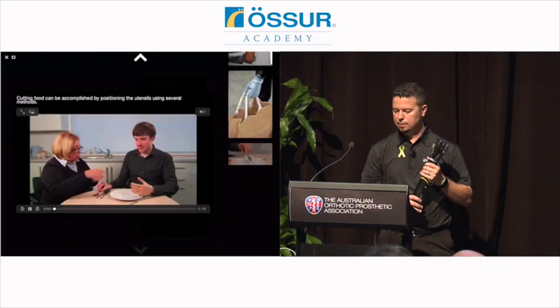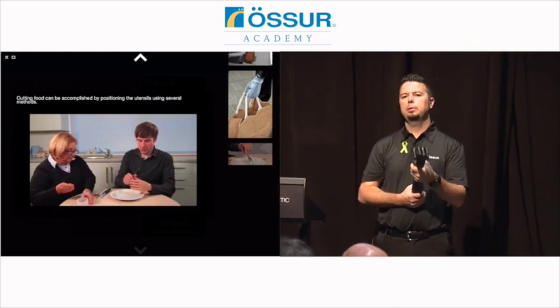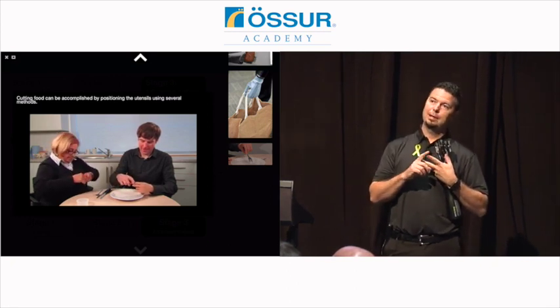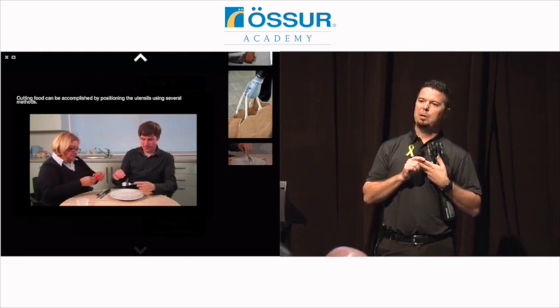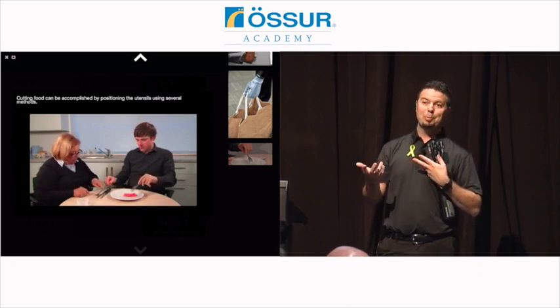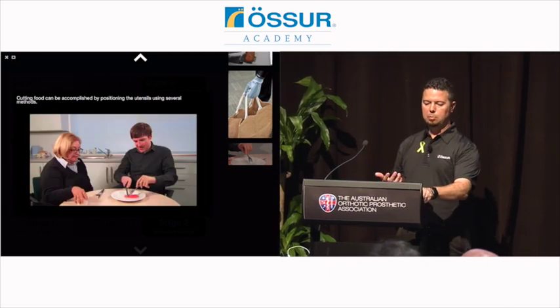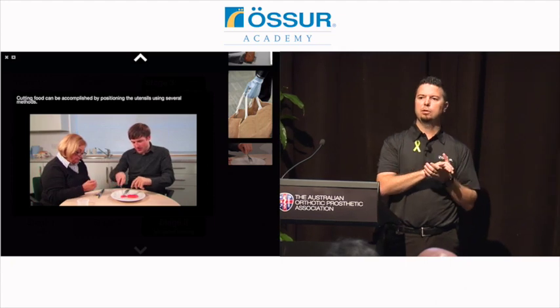And then the last thing is utensils. We did a study with a university in our area. We asked people, since their amputation, what was the most difficult thing for them to do, but most important to them? So it had to be difficult, and they had to care about it. And number 1 on the list was cutting food. And maybe that's just Americans, that we're big carnivores and we like to eat stuff, but most people like to be able to eat and be independent with that. So one of the things that you want to show somebody in stage 1 is how you can hold a utensil with the compliant grip, with the thumb rotation, to get that hand in different positions to achieve those functional goals.